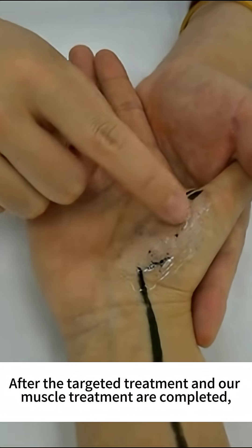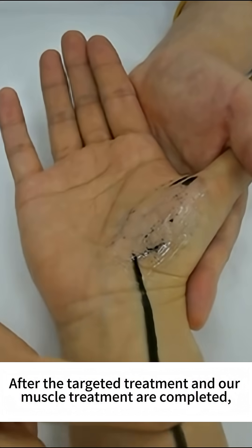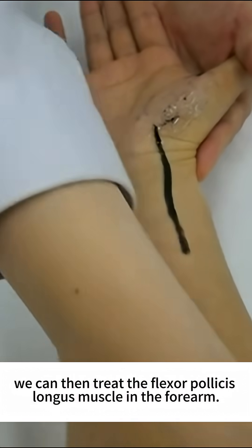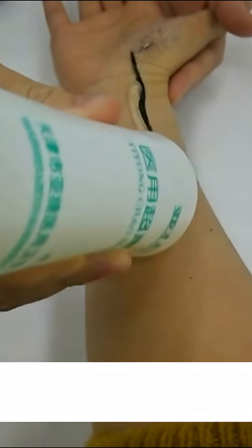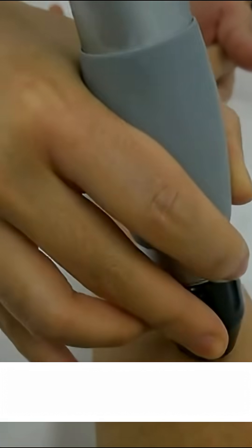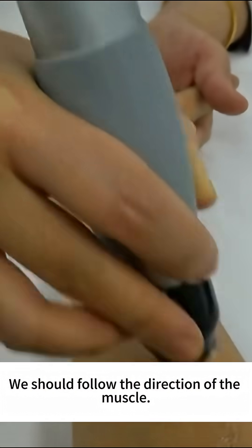After the targeted treatment and muscle treatment are completed, we can then treat the flexor pollicis longus muscle in the forearm. We should follow the direction of the muscle.